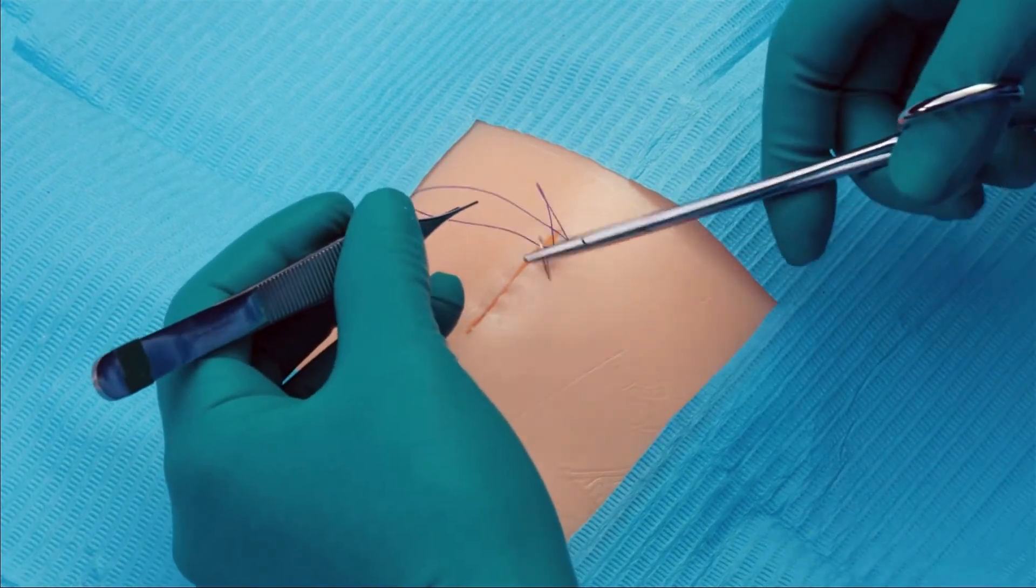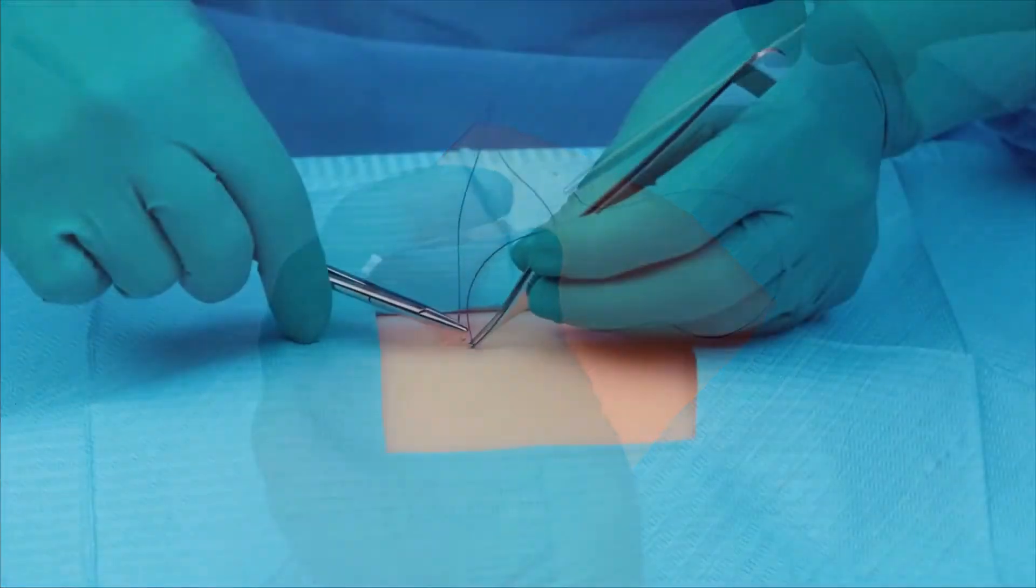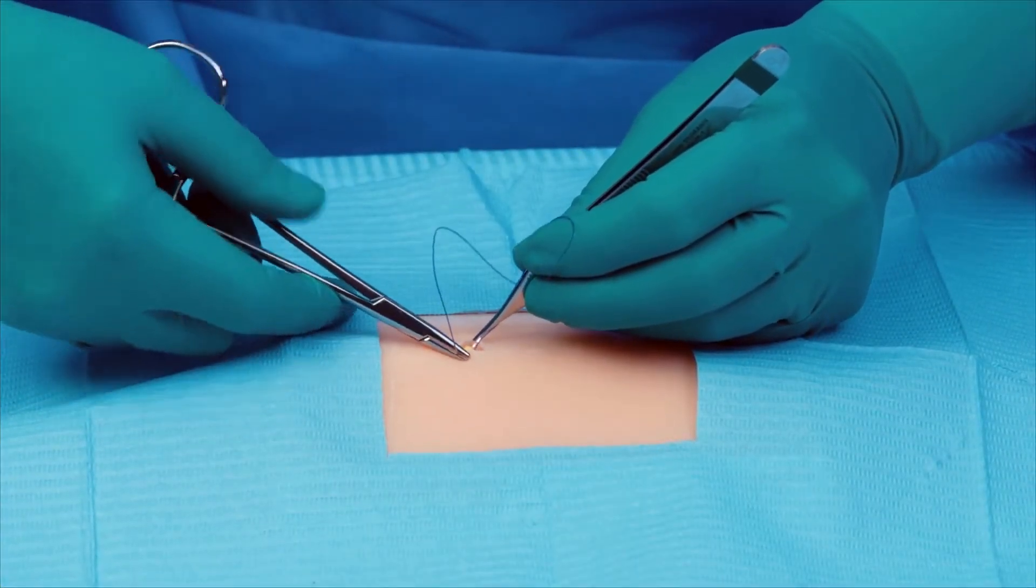And some people like to make most of these sutures loose in the beginning and then pull them tight. I like to tighten them each time.